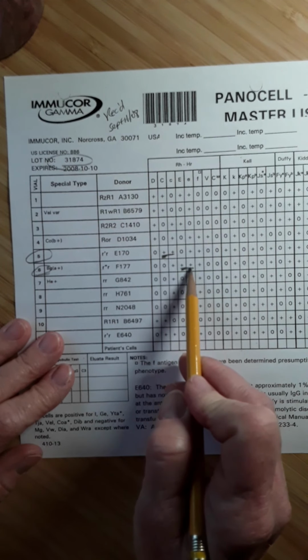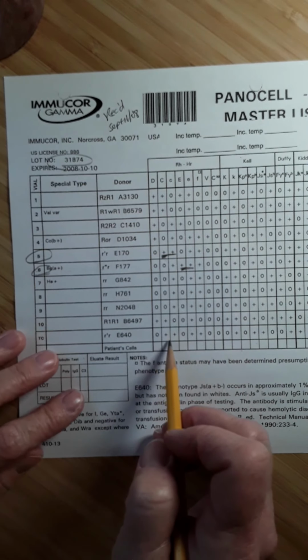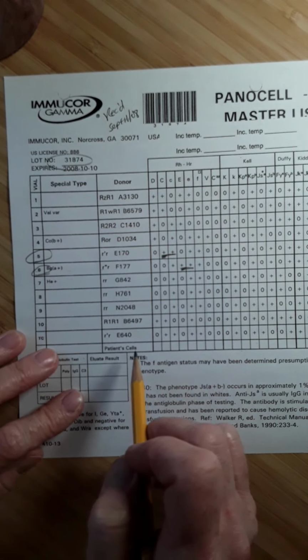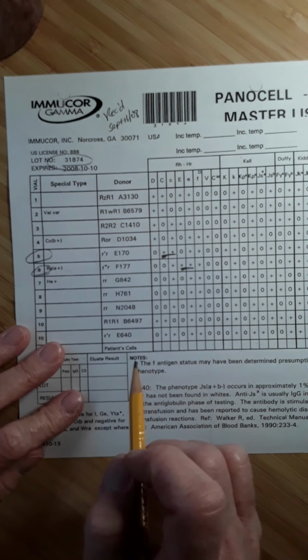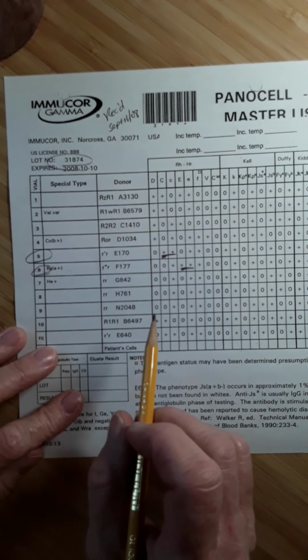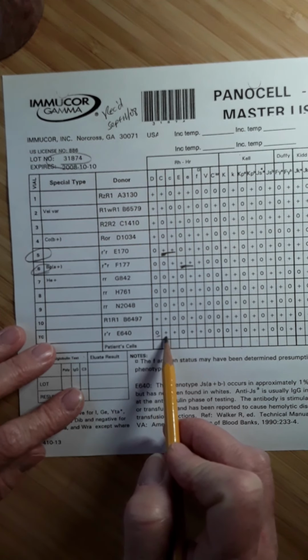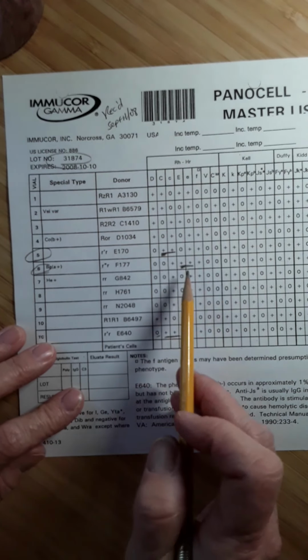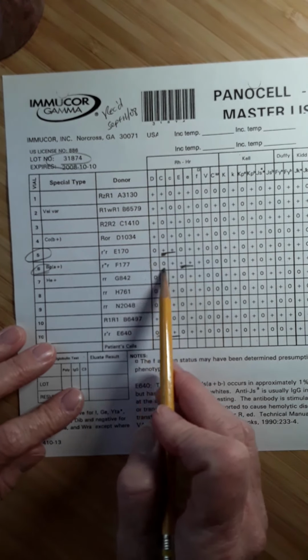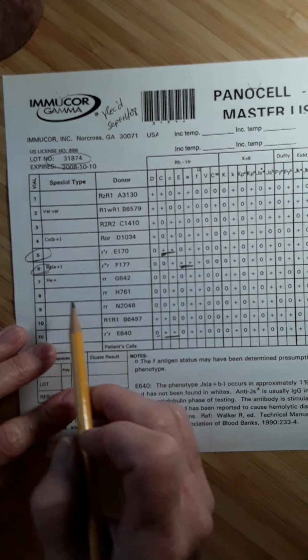Now they are heterozygous cells, so that's too bad, because I would actually prefer to use a cell that is homozygous for big C and react it with my patient's plasma. But I don't see that available to me. I have another negative D cell here, but again, it's heterozygous for C. And this is the only D negative cell that's positive for E. So I'm going to set up cells 5 and 6.